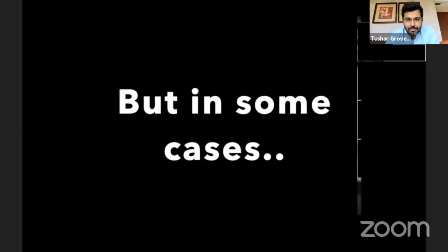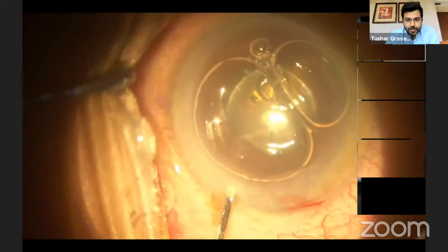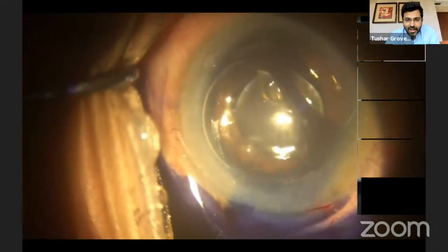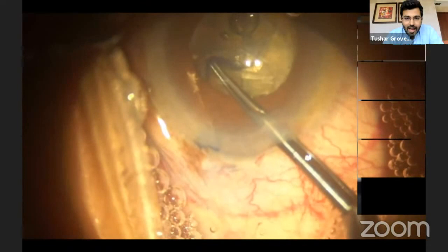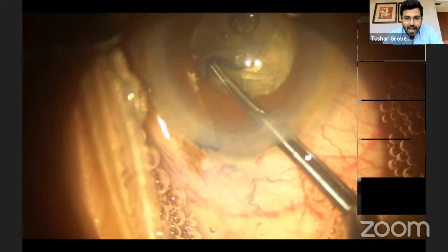But sometimes this can go wrong, such as in this case where once we took up the patient for surgery, we noticed that there was some pigment dispersion, which is why we stained this particular patient. When you look at this case, it's quite evident that a part of the capsulotomy by the femtosecond laser has been done over the iris. So the energy has been delivered onto the iris, and quite evidently there is an area of uncut capsulotomy.